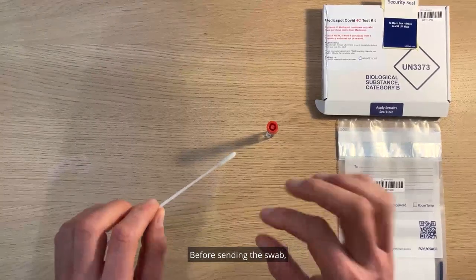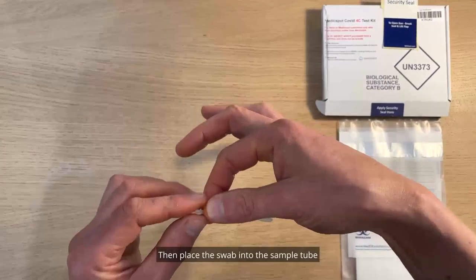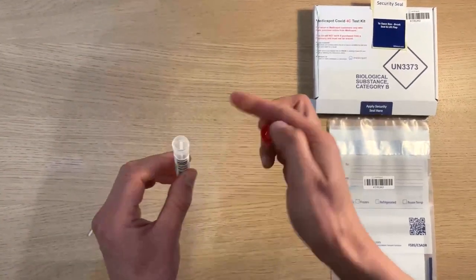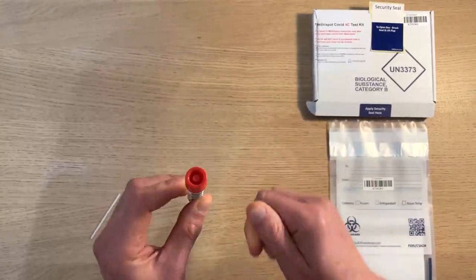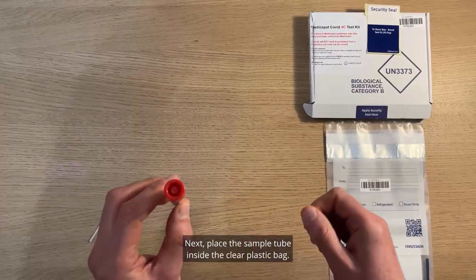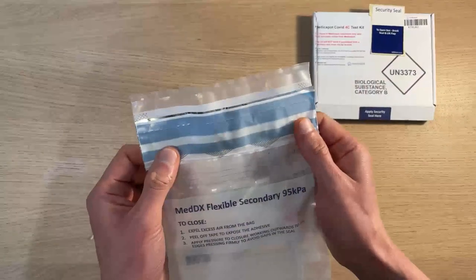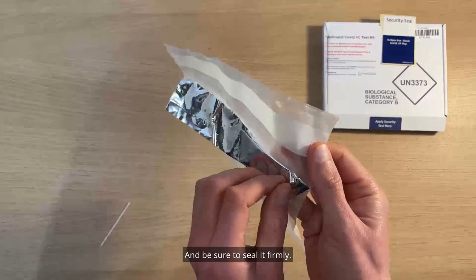Before sending the swab you may need to snap off any excess stem. Then place the swab into the sample tube which contains the liquid, and ensure the lid is closed securely. Next, place the sample tube inside the clear plastic bag and be sure to seal it firmly.